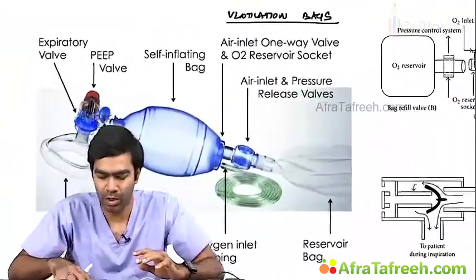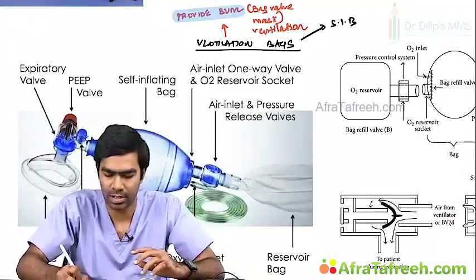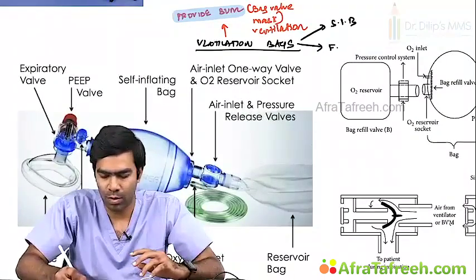Then let us move on to the ventilation bags. There are two types of ventilation bags. One is the self-inflating bag and the second one is the flow-inflating bag.